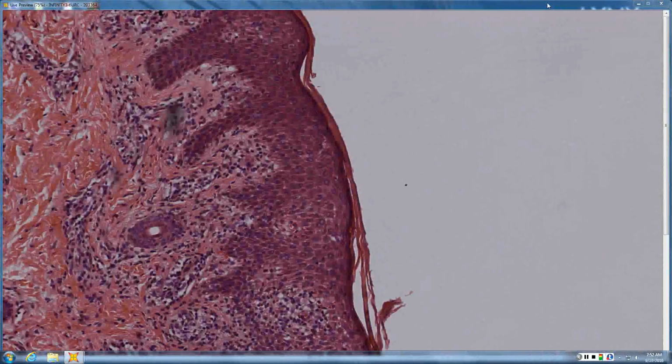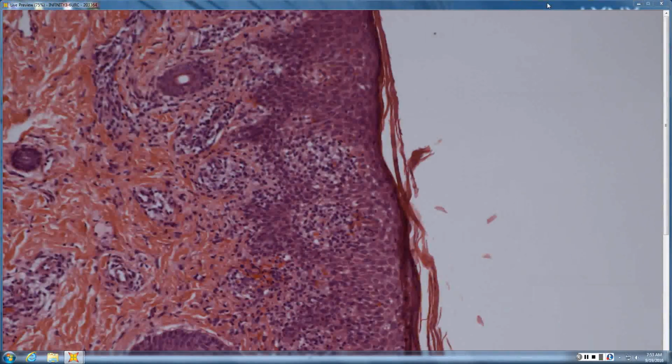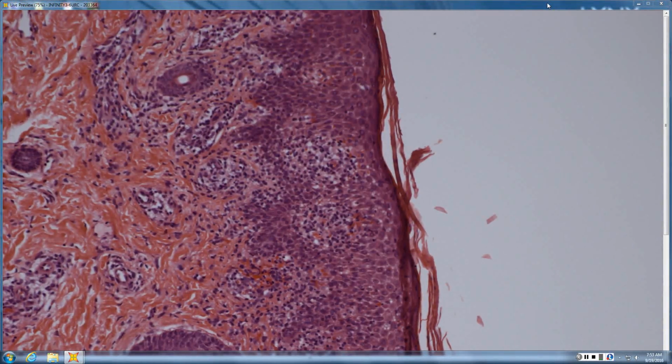Okay, Paige. I think this looks somewhat lichenoid. It's certainly interface, right? Are the rete ridges sawtooth or are they still round? I guess they're still round, so it's more vacuolar. And if it's vacuolar, then the next step is, do you have lots of holes out of proportion to lymphocytes, or is there basically a lymphocyte in every hole? I think there's pretty much one in every hole.